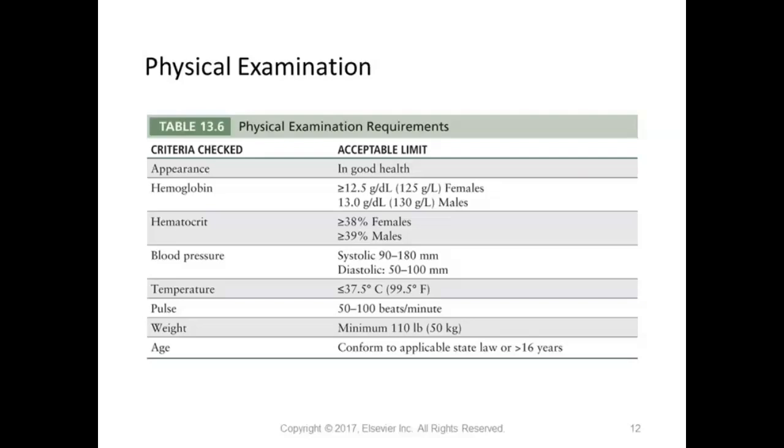Now these bags contain anticoagulant. So think of it like the blue top. There's a certain ratio of blood to the anticoagulant that you have to have. So that's why less blood is drawn, and then some of the anticoagulant has to be removed as well. So I guess a lot of donors do not. That would be, I guess, a lot of work, and of course, preparation and things like that.